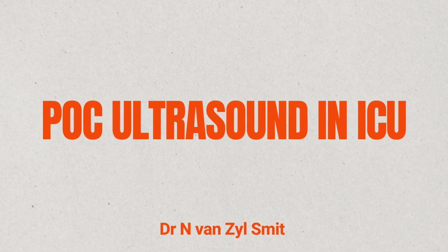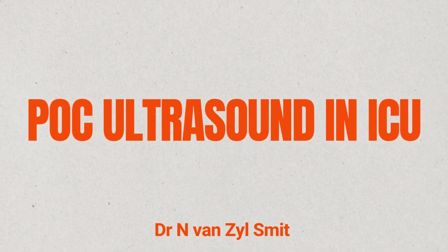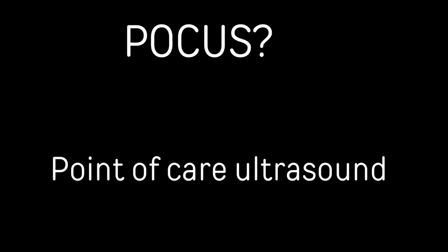Good afternoon, everyone. We're going to talk about ultrasound in critical care today. I know some of you have done the course, some of you haven't. So there will be some refreshing stuff, but then there will be some directed towards critical care and what we can do just to help us out.